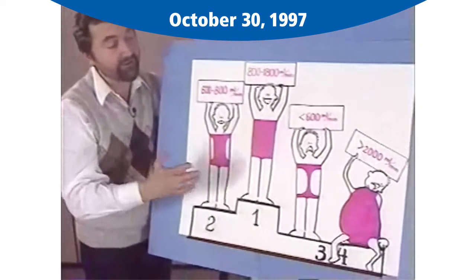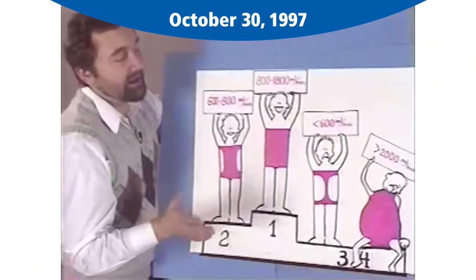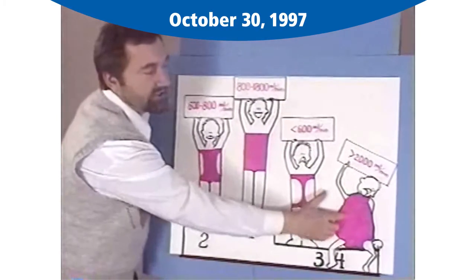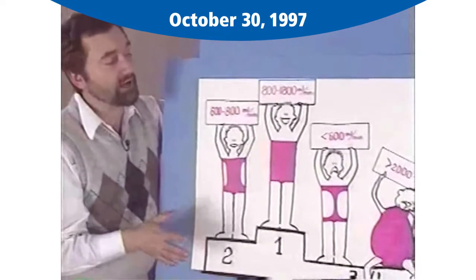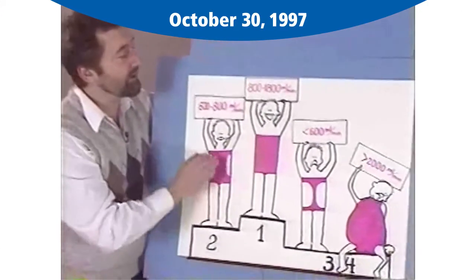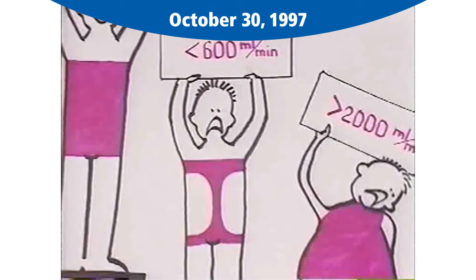Of course, we find that in some patients, mostly with native fistula, the access flow may be huge, 2 to 4 liters. Unfortunately, in this situation, the heart may be overloaded, and this patient is in potential danger. And we see in many situations that doctors make a compromise decision and, for example, band this vascular access to decrease the flow to save this patient. So what can we do when the access is going to clot pretty soon?